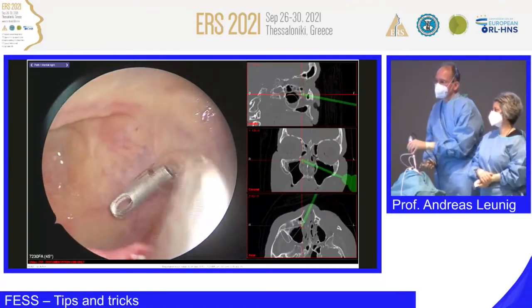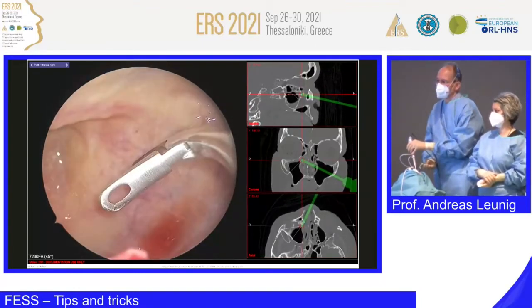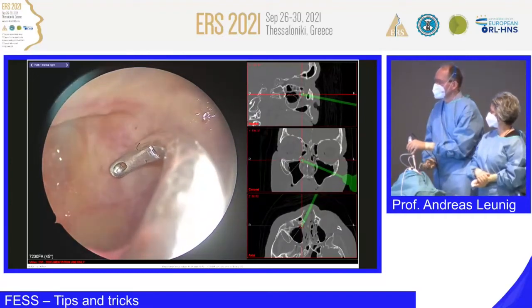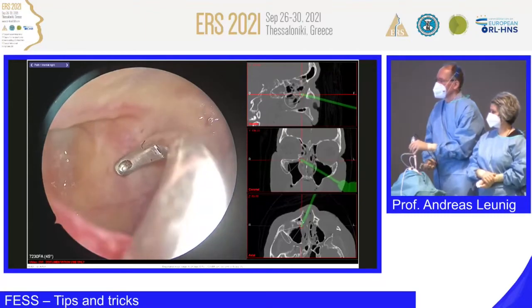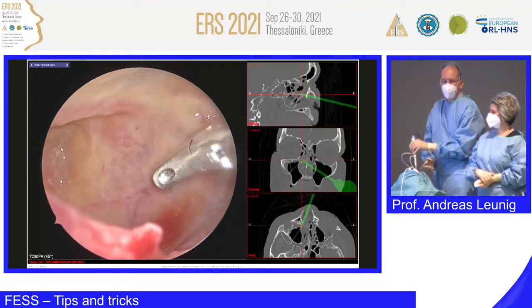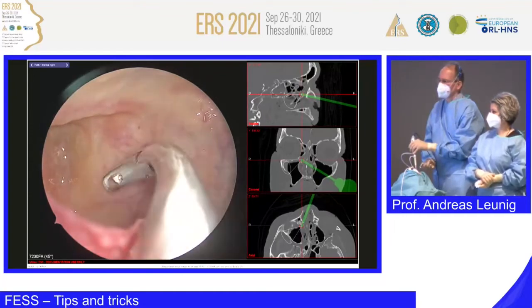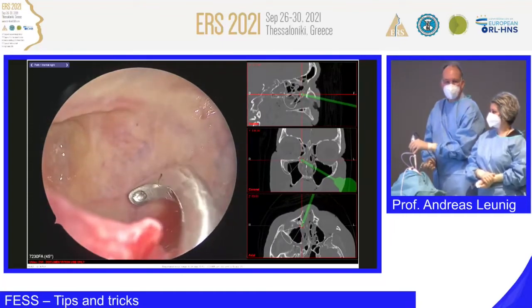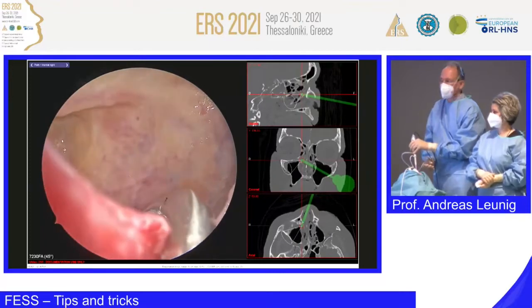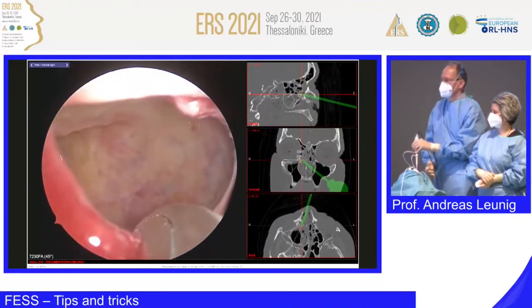And if this is not long enough, this instrument, there are more, I think there are two more types, a long version and the oversized version, the XXL. And there's another version which has a broad tip. It's called Flamingo. And so you can deal very nicely endoscopically with pathologies in the maxillary sinus.